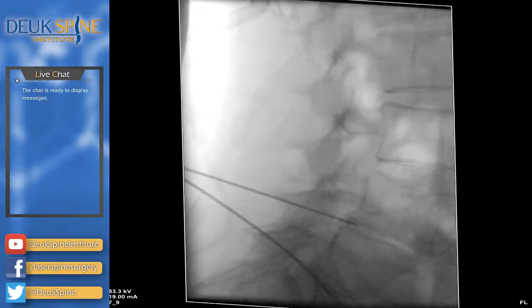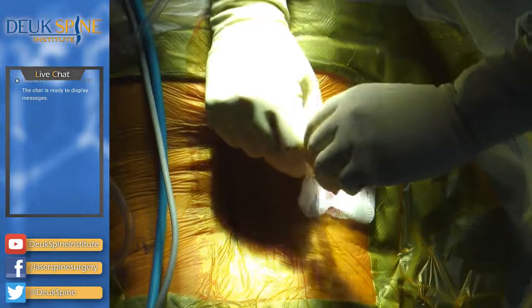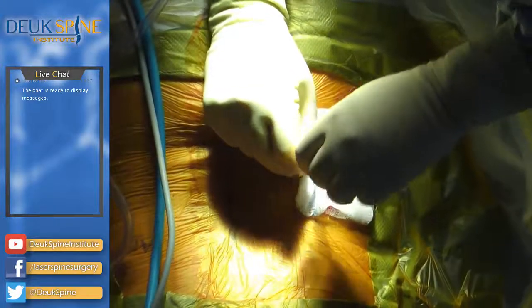These two discs, the bottom two, are really going to be tough because they're so collapsed. I got the bottom one, which is the worst. This one here, I'm still working on. But you're doing great. I just need you to relax your back.